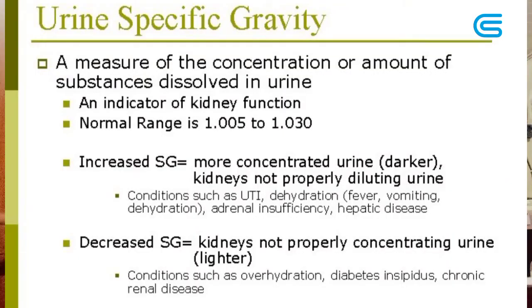Specific gravity. Generally, specific gravity is defined as the ratio of the weight of a fixed volume of solution to that of the same volume of water at a specific temperature. I hope you got that, specific gravity.